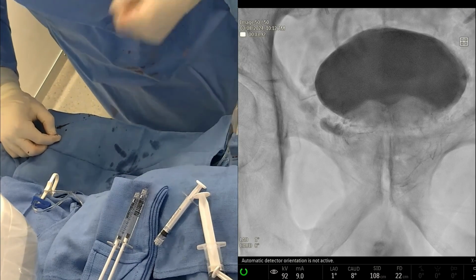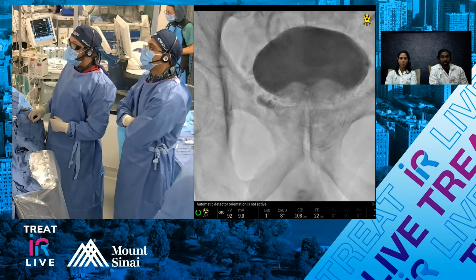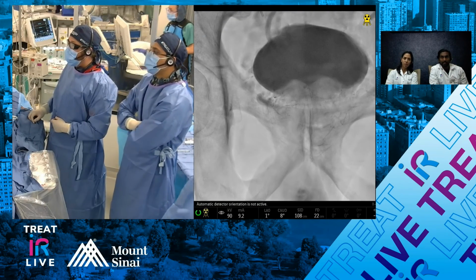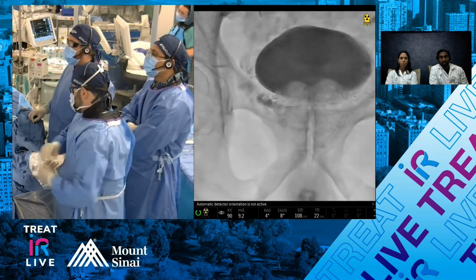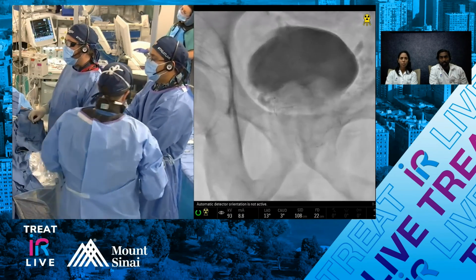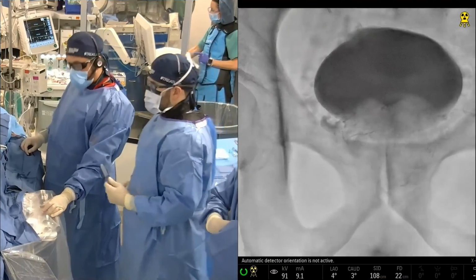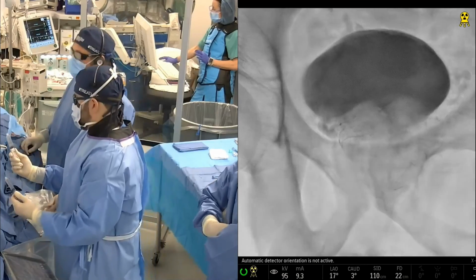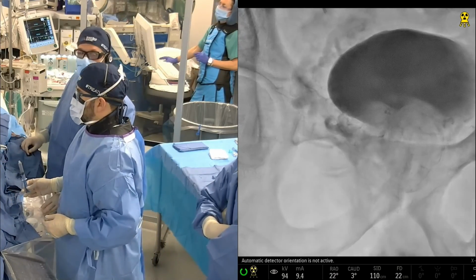So with it out, I don't know if you guys saw some of that percolating forward a little bit just because of how thin your dilution is, but it's obviously a very big difference. But we have a complete occlusion of the prostate artery here, which is nice. I'm just going to rotate a little bit so you guys can see. But the middle lobe is well treated. And we're probably going to get a few areas of necrosis on the MRI in 6 months. But I'm really happy with this result. Are you guys happy? Great.